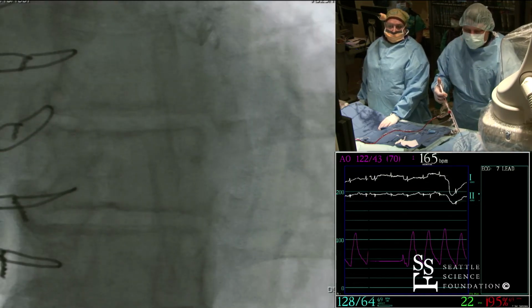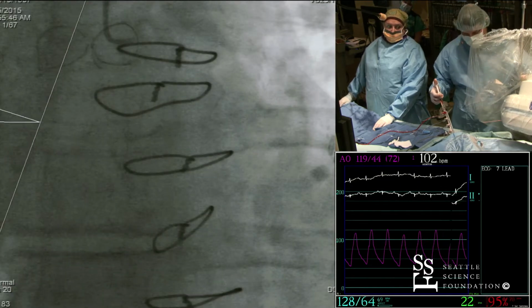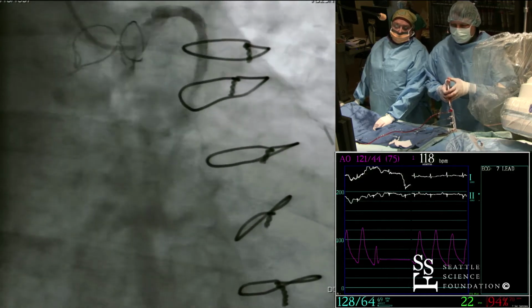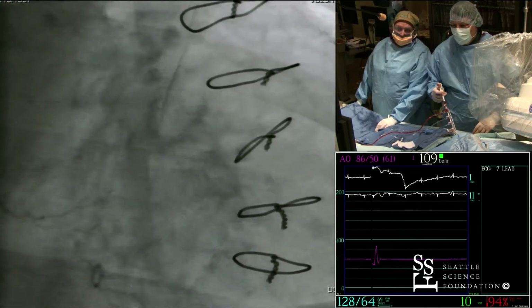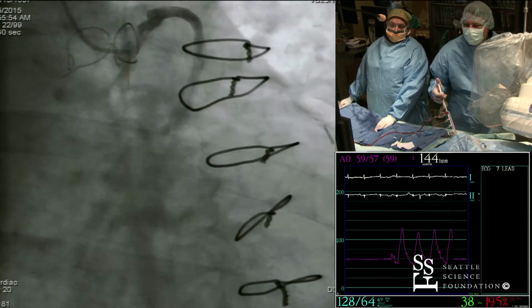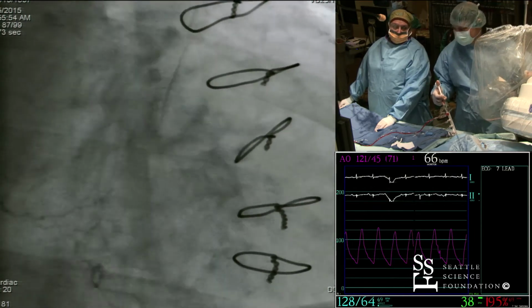Go to RAO. I'm sure it's still in the catheter. Yeah. Okay. Through the RAO. The other negative about the wrist is you really can't get true lateral views. It does limit what you do with lateral. You can if you shoot through the arm. You just got to be comfortable with that. Mauricio and I were taught to use a 90-degree lateral. He'll remember that.